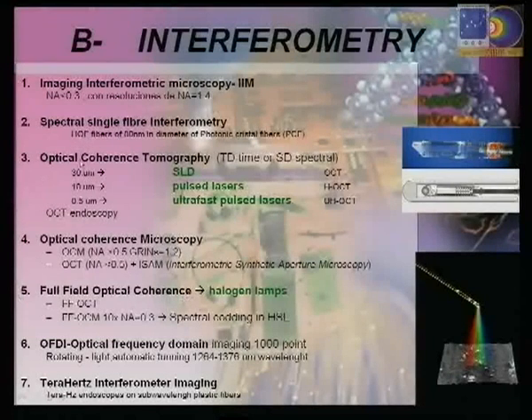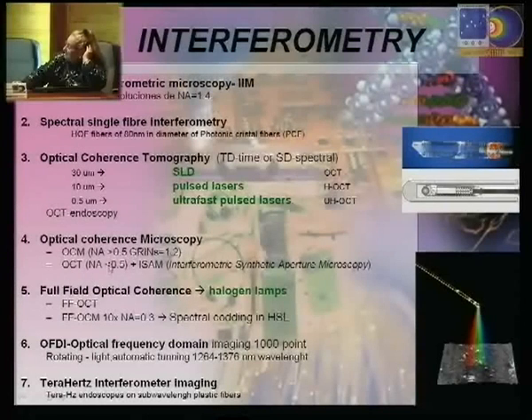The difference in microscopy obviously depends on the lenses, that means the numerical aperture of the optics, which are on the top of the fiber.